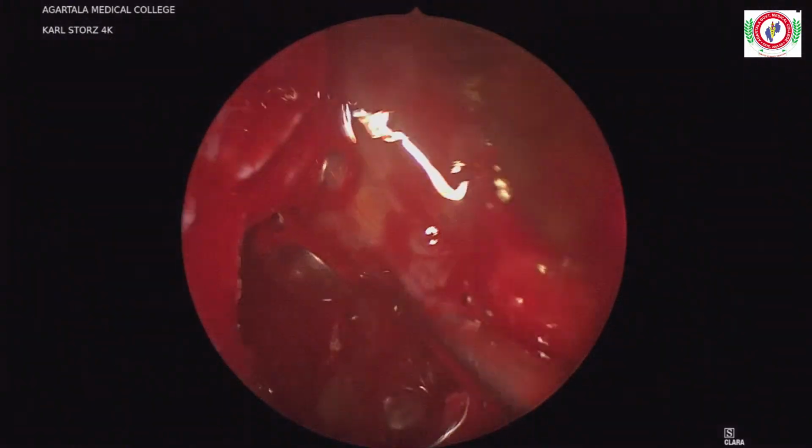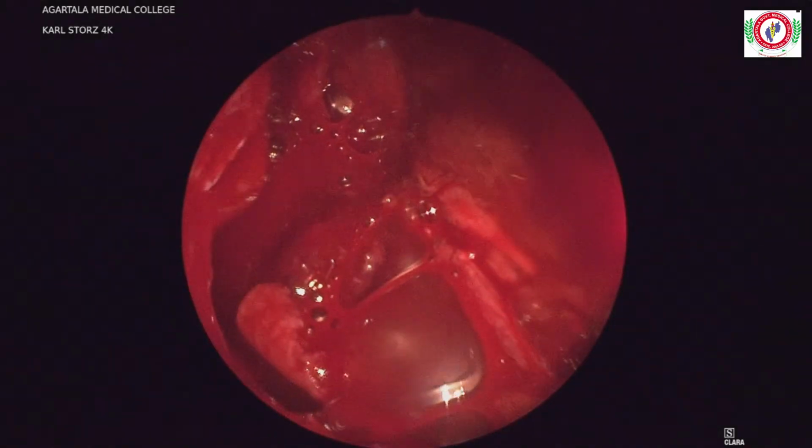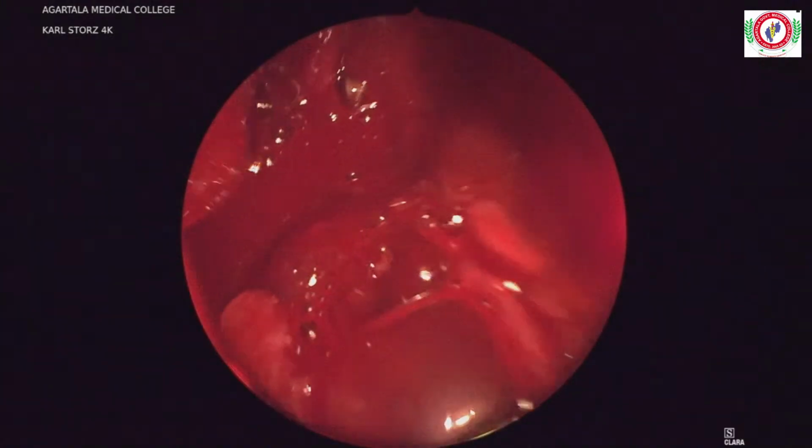Upturned forceps. So I'll try to take it out now.